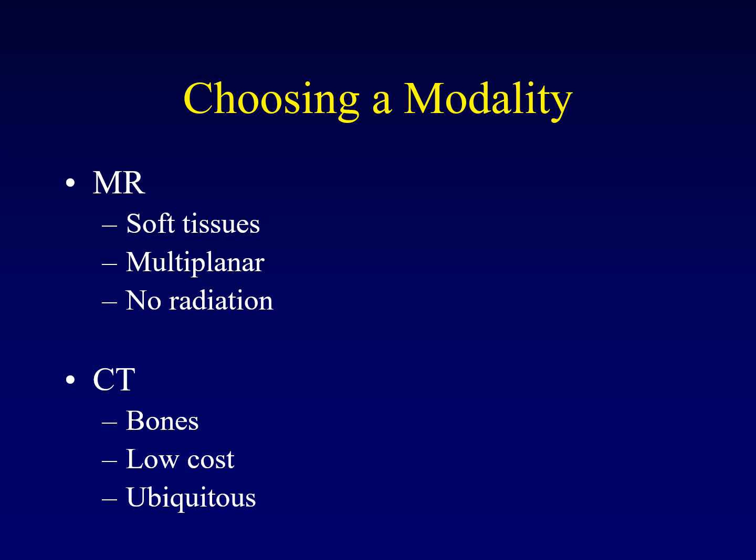MRI is a little more tricky. You got to schedule things in advance. You need to be cleared for the MRI to make sure there's no metal in your body. CT, if you need it right away, you get it right away.